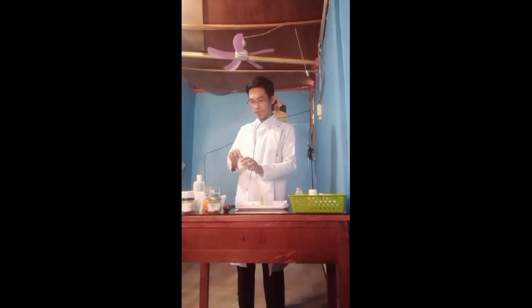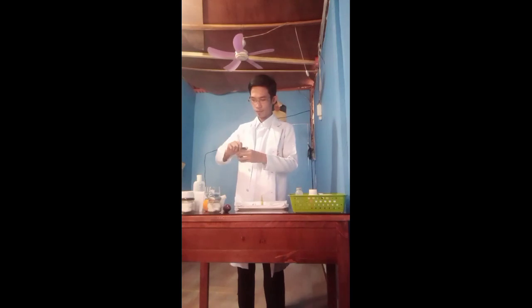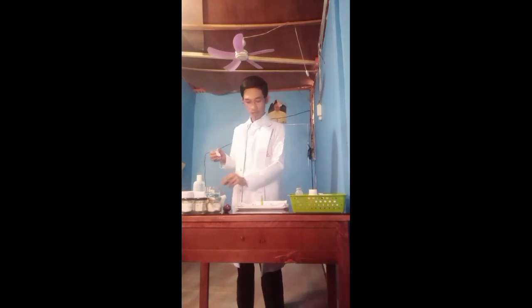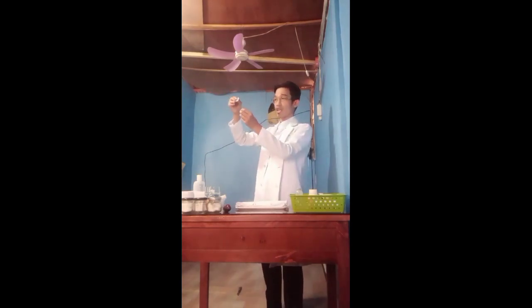I have here the alcohol swabs. So put it in the waste receptacles. Then snap the neck of the ampule quickly and firmly away from your hands to protect your fingers and face. So if you are going to break this, it's like this to avoid injury.